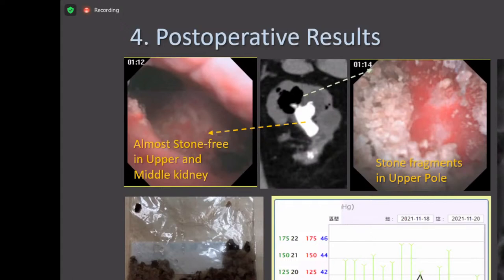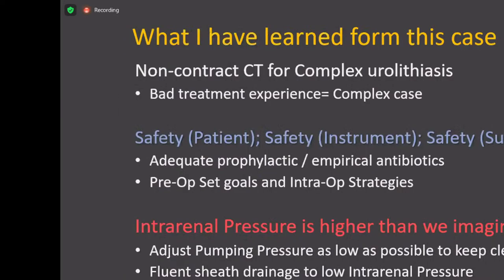And I think it's the right thing, because if we want to remove those stones, maybe you can get high complications. So this is a fascinating case to share my experience. It's actually a really complicated case, but if we are well prepared and have better surgical tips, we can still deal with those complications, even with EPN, carefully in a single surgery.